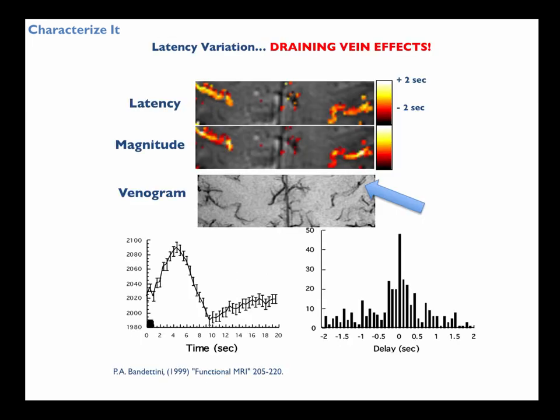Okay, so other aspects of the dynamics are how much temporal resolution can you get? So we can see that you can get very brief stimuli. You can collect very rapidly. You can collect as low as a TR of 100 milliseconds if you wanted to, 400 milliseconds for whole brain now. But it turns out that what you're really limited by is the hemodynamic response.